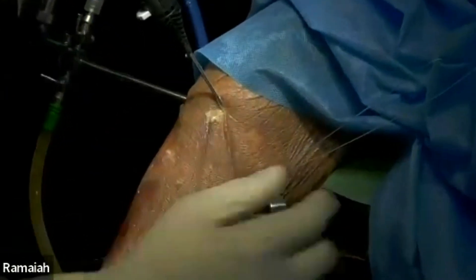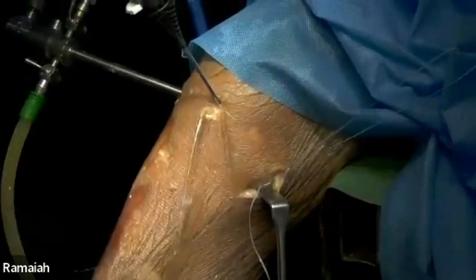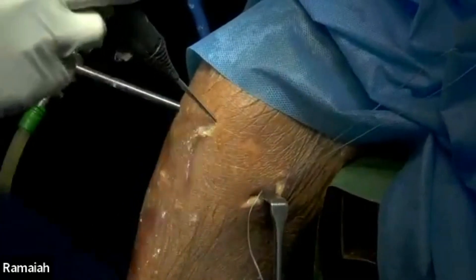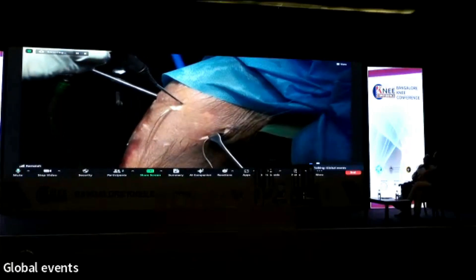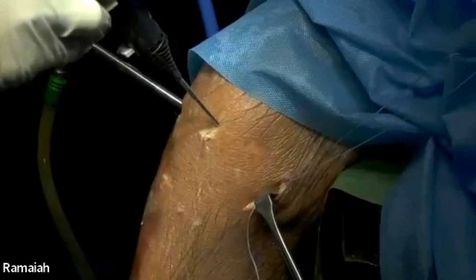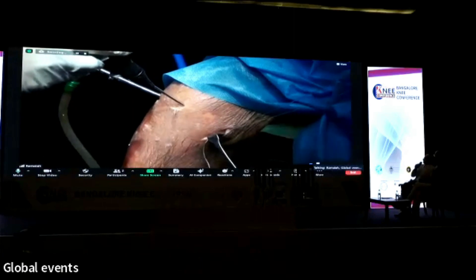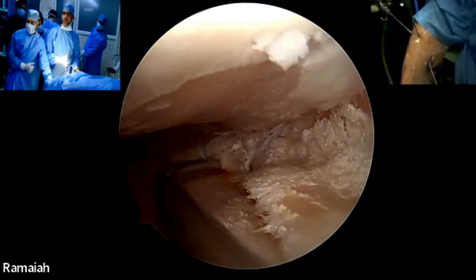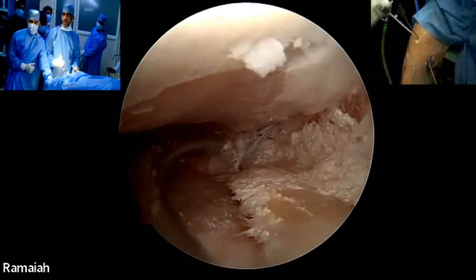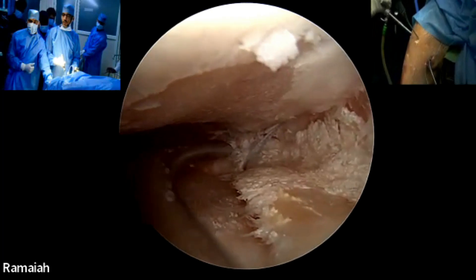One set has already come out through here; this is the next one we are doing. You can put your sutures as vertical or horizontal mattress — whatever configuration you want. Now I am going to readjust to where I want to put the next stitch. If it is a vertical longitudinal tear, I'll put one here. If it is a cleavage tear, I'll put here. If you want to put a mattress, then I'll put here — you can change your configuration as you like.